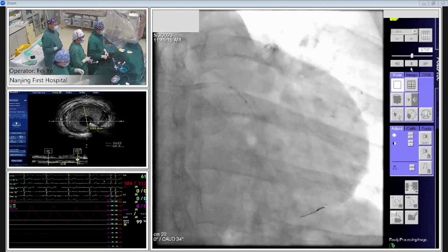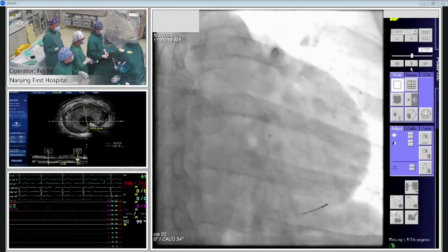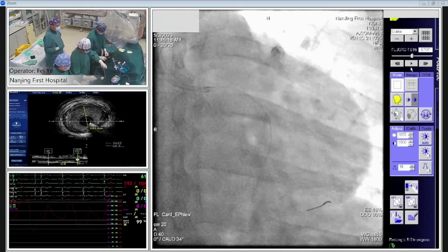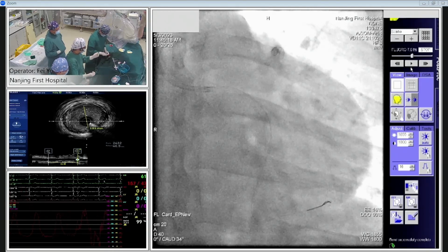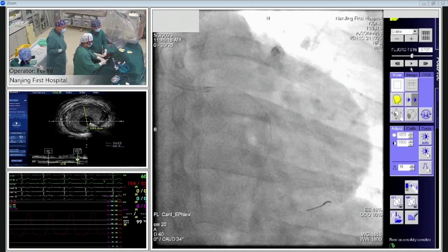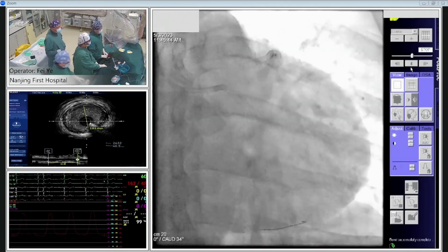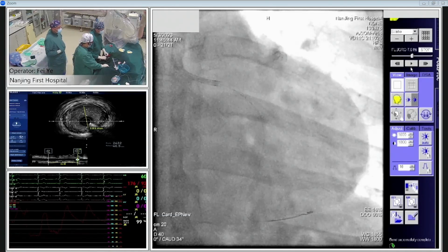So what's the key point of the final part of this kind of application? The question is to avoid touching the carina. Just because if the final part crosses over the bifurcation side, we will make the side branch ostium pressure a little damped. Yes. Sorry, maybe it's too deep. Yes, keep stable. Yeah, it's too deep.